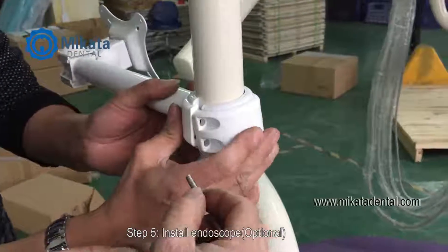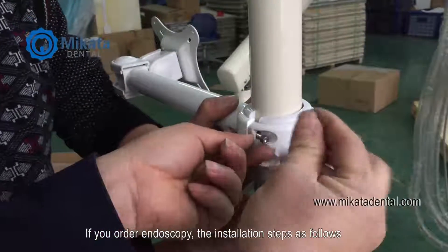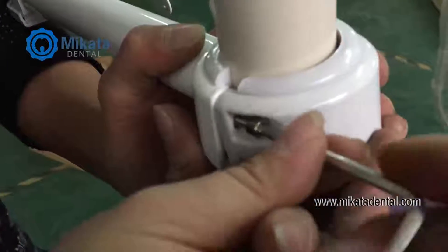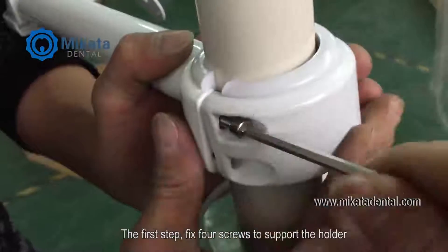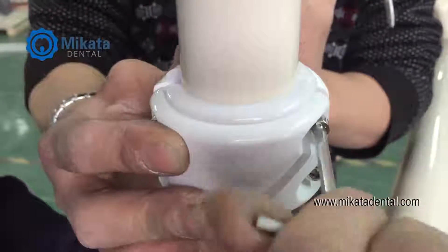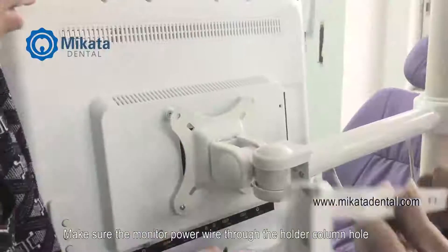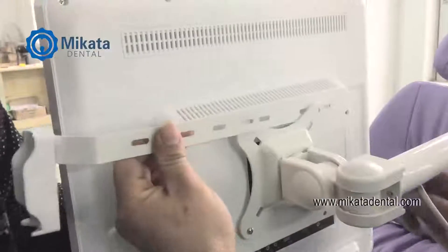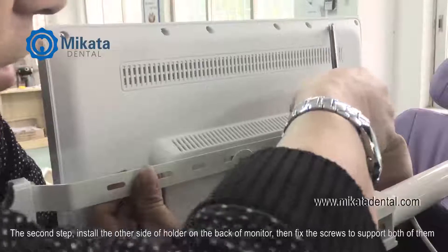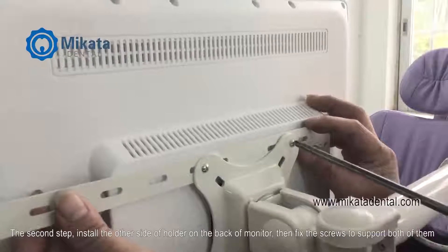Step 5. Install endoscope — optional. If you order the endoscope, the installation steps are as follows. The first step: fix four screws to support the holder. Make sure the monitor power cable winds through the holder column hole. The second step: install the other side of the holder on the back of the monitor. Then fix the screws to support both of them.